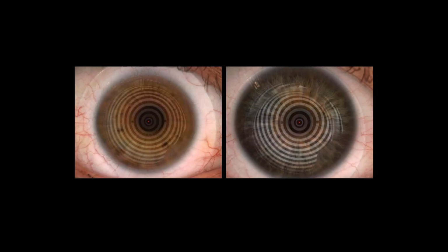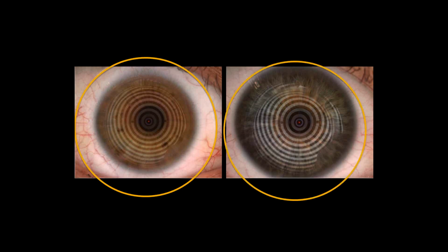Here are two examples that I've pulled out. There's a small eye, closer to that smaller than average eye size. We can see that the lens is a different fit. If I outline where the lens is sitting, it's not hard to see that the lens is sitting differently in the image on the left versus the image on the right. The eye on the right is over that 12 millimeter range, so that's a larger than average eye.